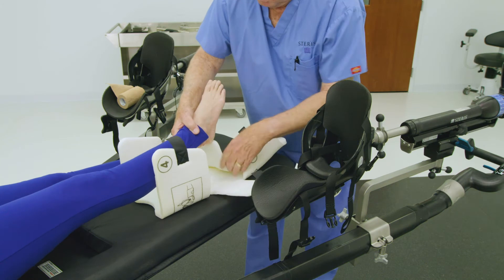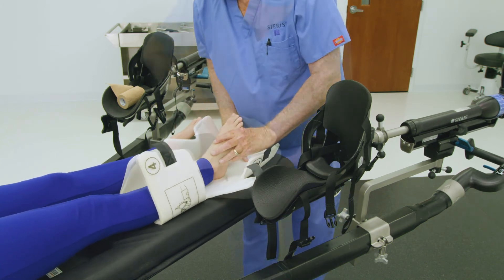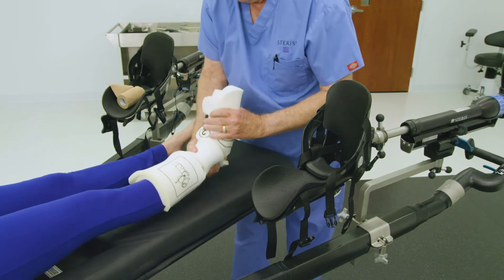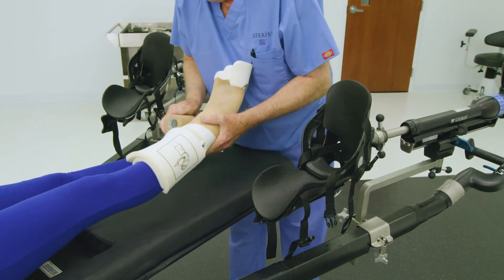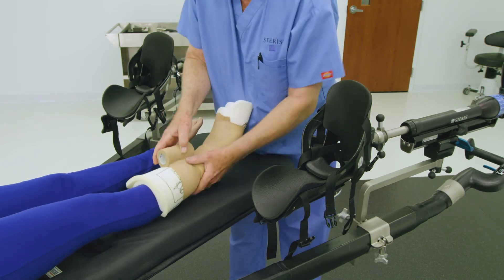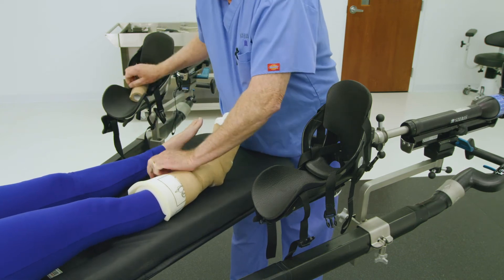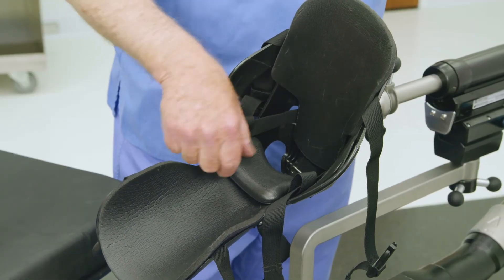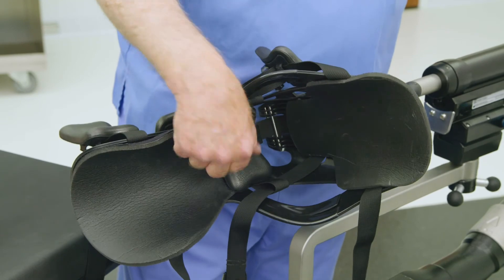Before placing the patient's foot in the traction boot, it must first be placed in a Steris traction boot disposable pad or prepped using local OR materials such as gauze wrap and coban. If using the Steris disposable pad, instructions for placement are located on the disposable pad itself. Once the foot is prepped with padding, ensure that the floating Achilles tendon pad is positioned appropriately and is not stuffed down into the heel area.